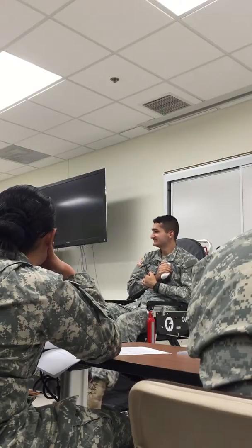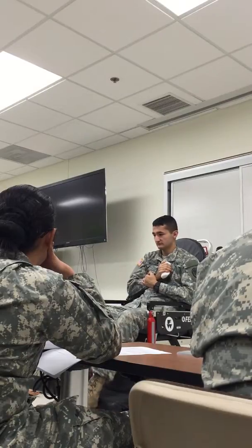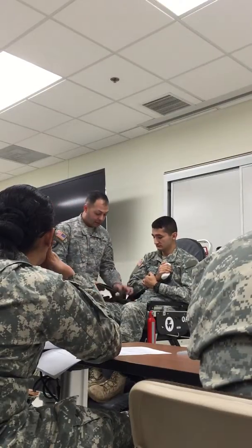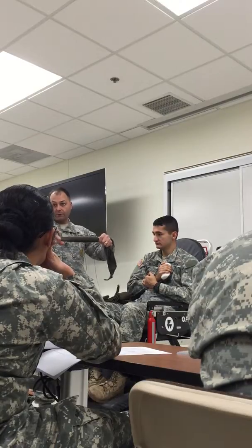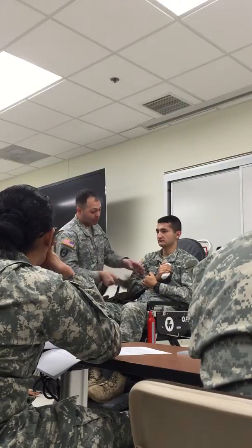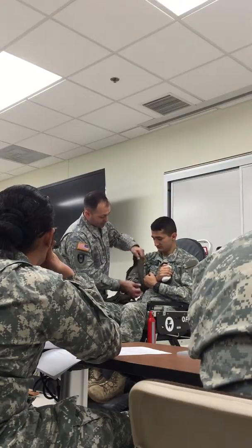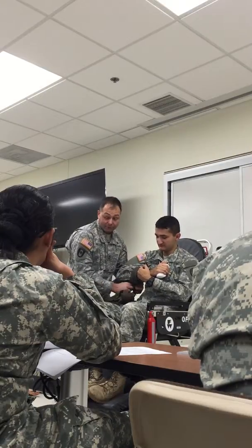All right, sorry, Les. You said immobilize. So I'm going to take, 1, 2, 3, 4 cravats because that's all they had, and I'm going to apply one below, one above, or other way around. One above, one below, the one above that, and one below that. So making sure not to be on the fracture site, I'm going to wrap and tie a non-slip knot not on the fracture.